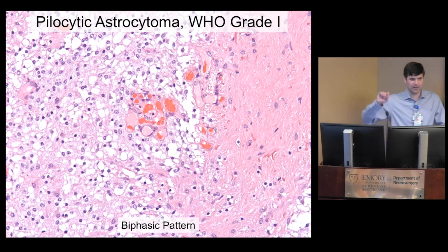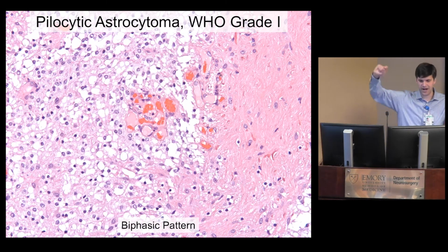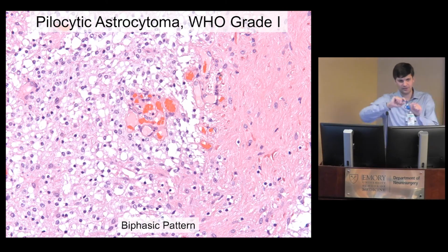It means hair-like. If you were to do a smear of these tumor cells, you would see a little elongated nucleus and two little glial processes coming off the two ends, little bipolar tumor processes that look very thin like hairs. So you smear these out, it looks like it has a bunch of hair in it, and you're like, oh, pilocytic.